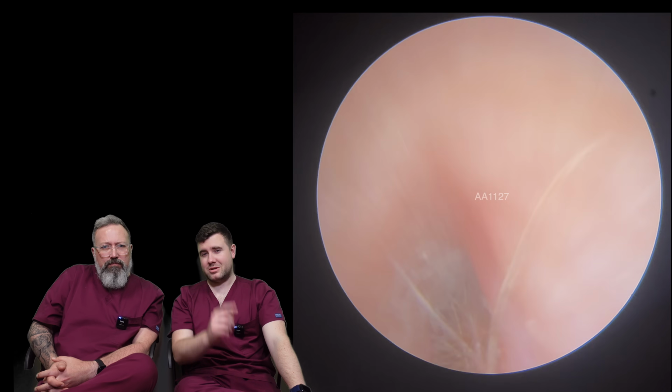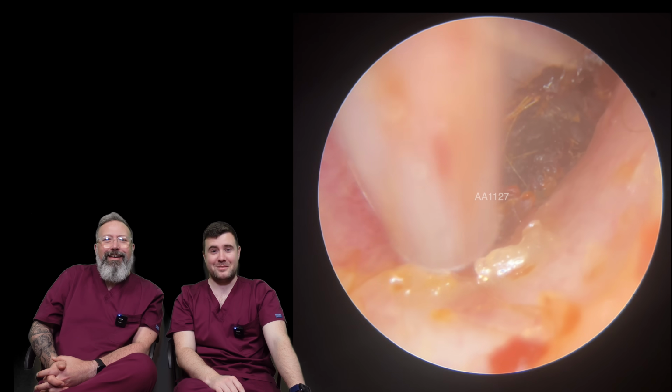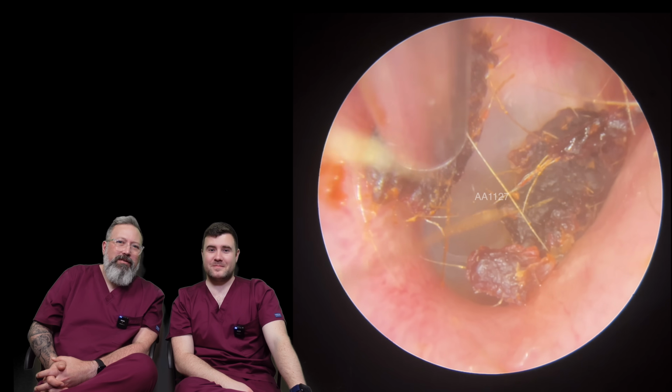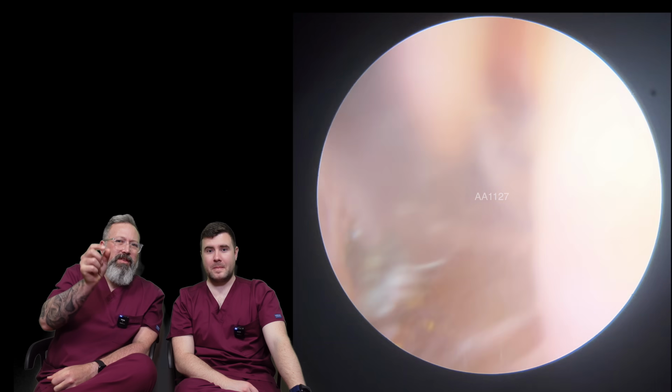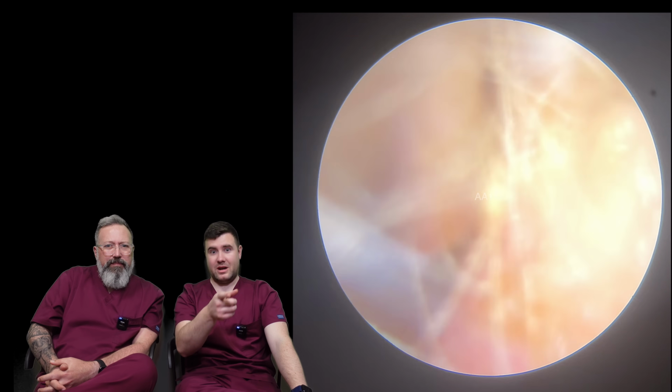I think I probably remember what's going to happen. I'm going to catch a little bit of skin or something, and it's just going to start peeling down the ear canal. Usually what happens when you get really long ones like this. Oh, it's not too bad. Oh, that's dry though, isn't it? It was a good job. I didn't think you'd get a hold of that because it was such a thin plate. I was hoping that is going to happen for the rest of it.